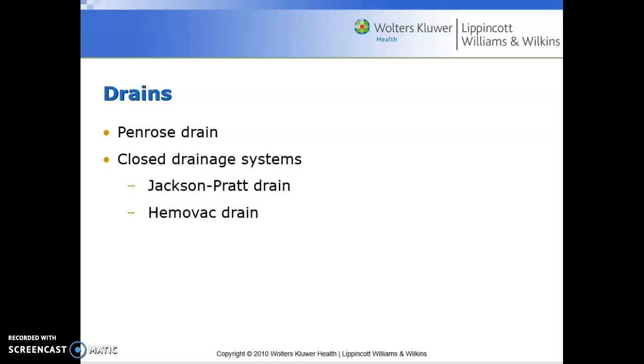Chapter 3, Video 4. Today we're going to talk about drains. We've got different types of drains. We have open drains and we have closed drains. The Penrose Drain here, the Penrose is an open drain. The Penrose allows fluid to collect in the wound dressing away from the wound, okay?